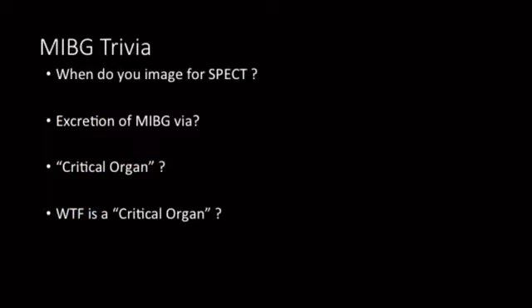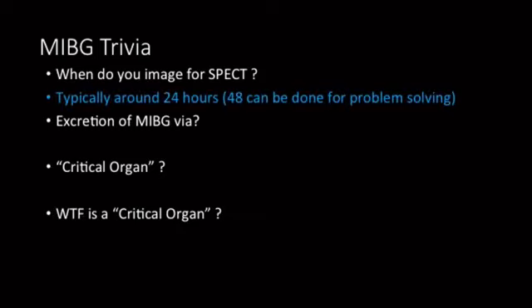Okay, so when you do SPECT for MIBG, when do you do it? And what I mean by that is, when do you stick them in the camera relative to the time after you've given them the dose? So typically this is done around 24 hours. Now you can wait until 48 hours for problem solving to get an improved background ratio.